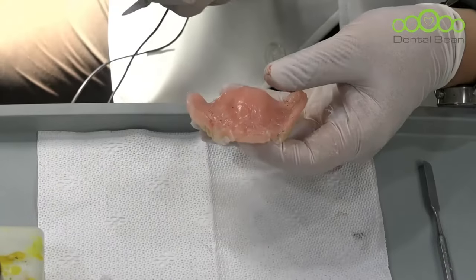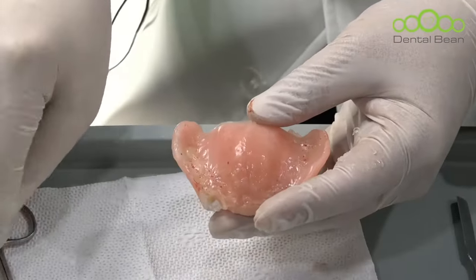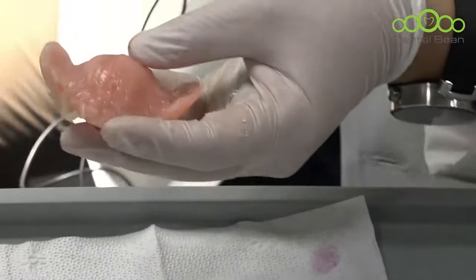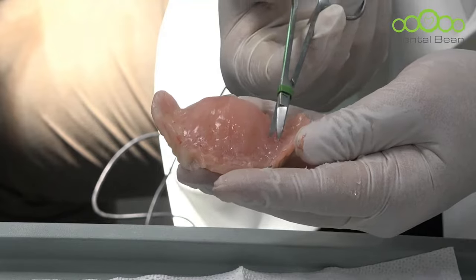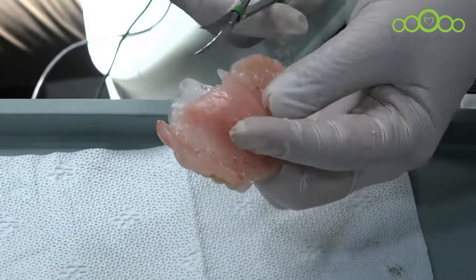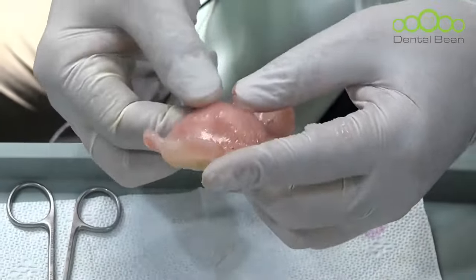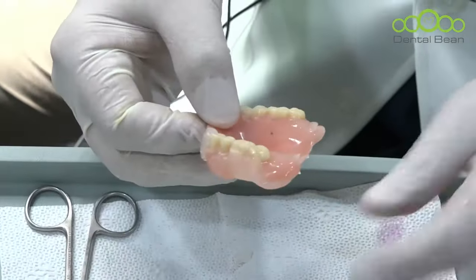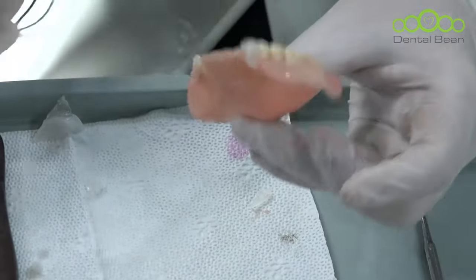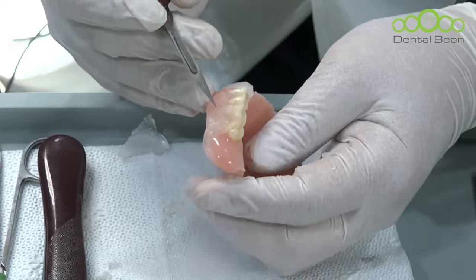And then you should remove this excessive soft liner. Some soft liner flows inside the implant site, so you can see the projection here. Please remove this excessive soft liner from the polished surface. Please prepare the knife. It is good to use a sharp blade to remove this excessive soft liner from the polished surface.